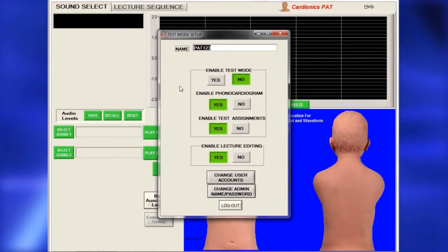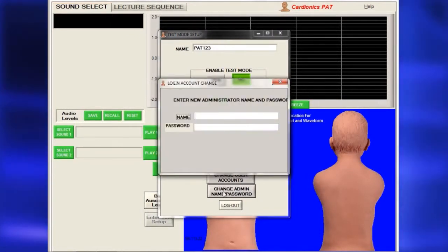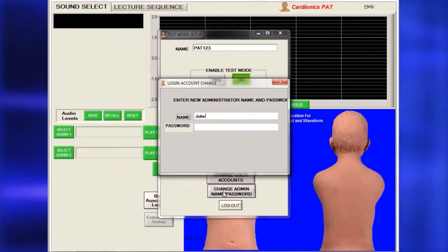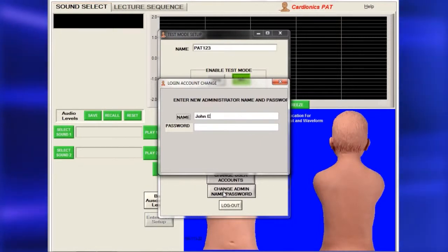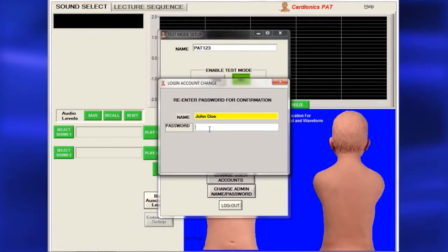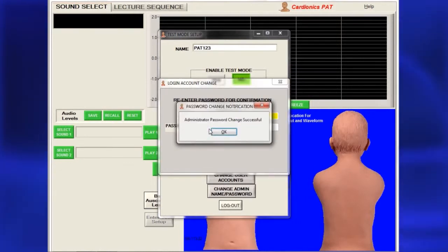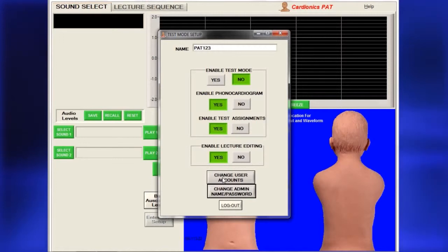You should change the name and administrative passwords from the factory default. Click Change Admin Name Password to bring up a dialog. Fill in the name and select a new password. You will be asked to enter the password twice, and a message will confirm that it has been successfully entered. Press Enter and a dialog will appear with the new name. You must log out to complete the password setup.